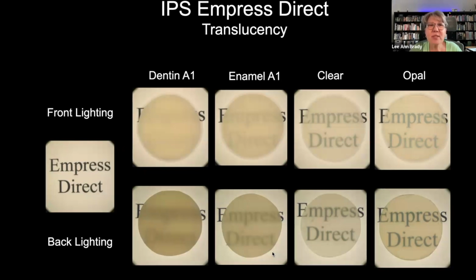And value comes down to, when we're talking about composite, the inherent light properties of the composite material, right? So on a scale of 100% opaque to 100% translucent, can we match that translucency versus opacity or light reflection using composite that we have in the tooth between the combination of enamel and dentin? And then the second part of value is creating the surface morphology. Okay. But the biggest, trickiest part of this is matching the material.